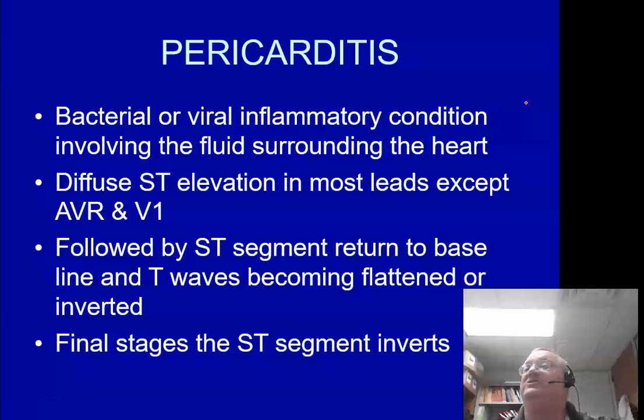You're going to have elevations everywhere. You're going to be thinking, oh, this guy's having the big one. Well, he's actually not. With pericarditis, the very simple treatment for it is, again, it's a bacterial infection.